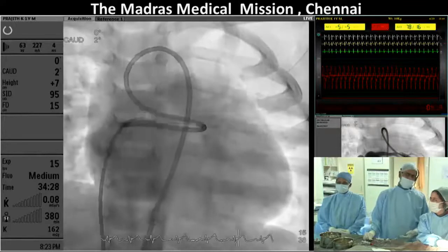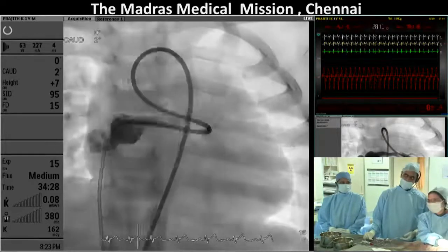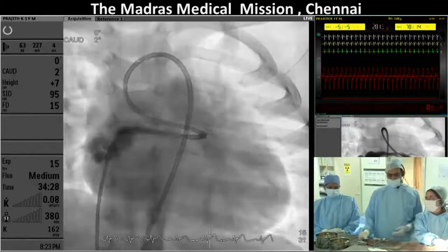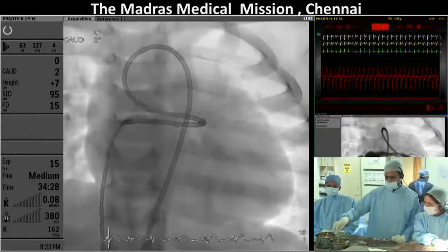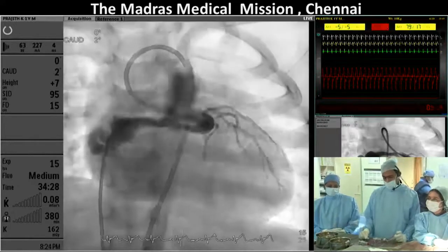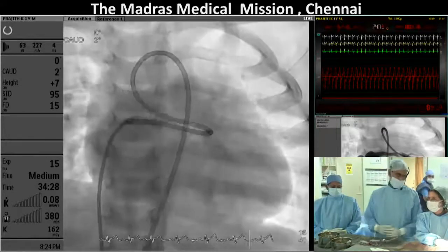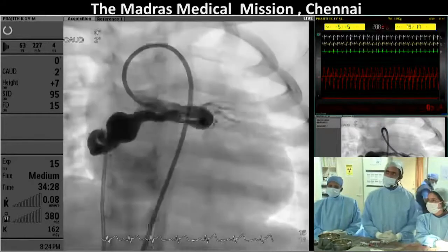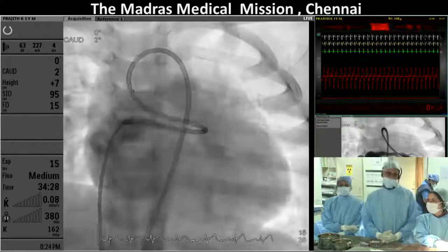But how will we protect the sinoatrial nodal artery? It will thrombose tomorrow. How will a coil... A coil is not an incomplete occlusion. Well, I agree with not sacrificing the sinoatrial node artery because I had a very bad experience in doing that, and you can see changes on the ECG immediately.